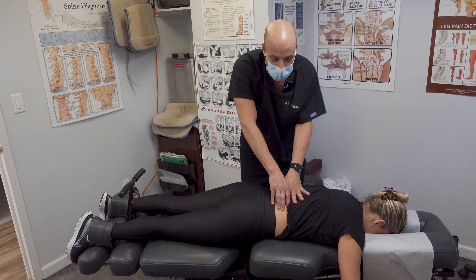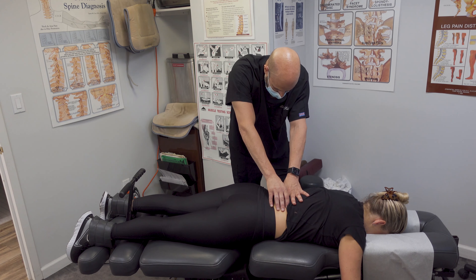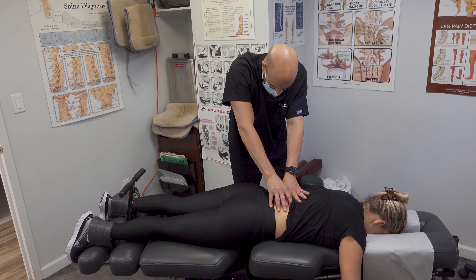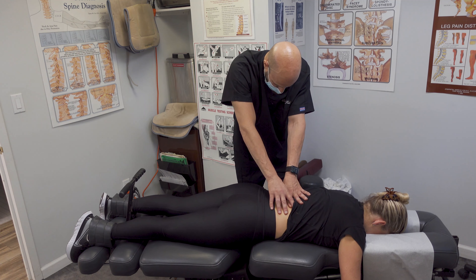After we do that we come in here and loosen up the soft tissue around the spine. Go ahead and take some deep breaths in and out. Once we're able to loosen up the muscles along the side of the spine — the iliocostalis and the quadratus lumborum — that really opens things up. Then when I go back to do the flexion distraction technique we'll feel some releases in the spine. When I was just doing that, was it stiff across your lower back? Okay, so I'll do it again and it should ease up a bit.